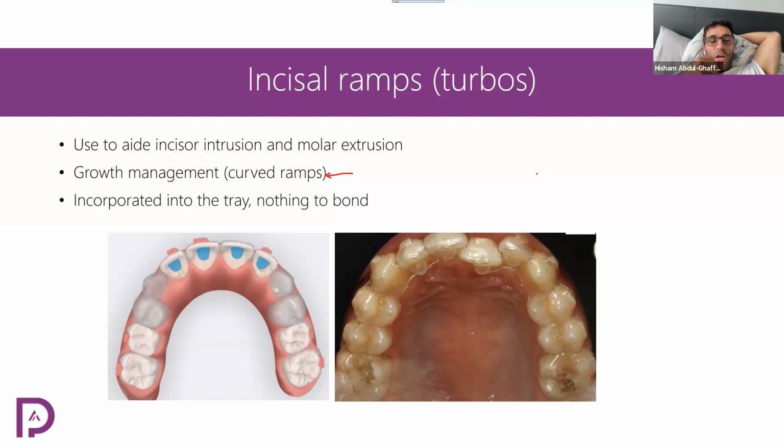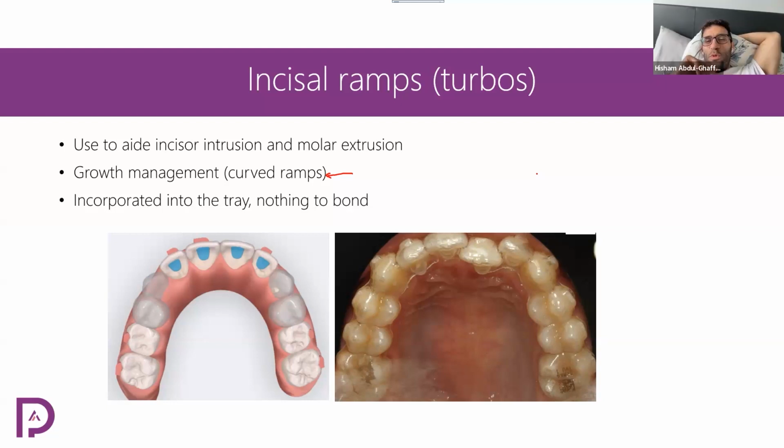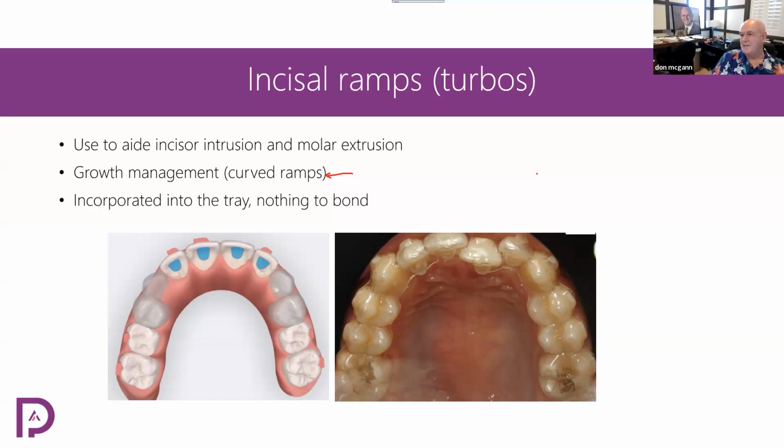So if the patient has a deep bite, would you still put turbos on the 6s? Well, in a deep bite you prefer to put the anterior bite ramps where you can. Where you can't is when you have too much overjet. If you have too much overjet and a deep bite, it's a tough situation. If you're doing growth management, then you'll accept some molar intrusion for the class 2 correction, for the AP. But to answer your question, I don't usually do that. The aligner's enough.